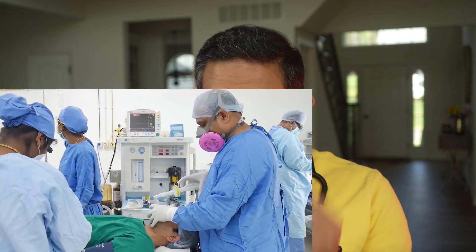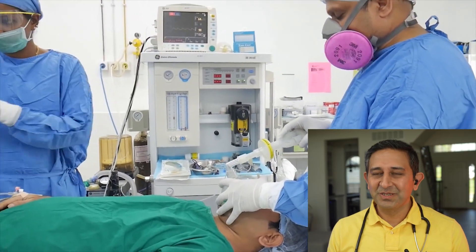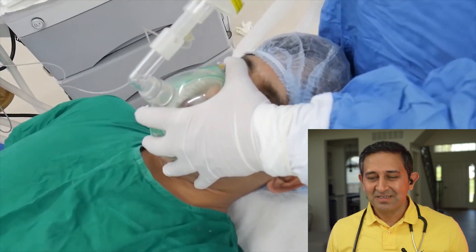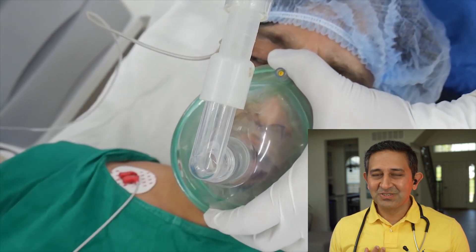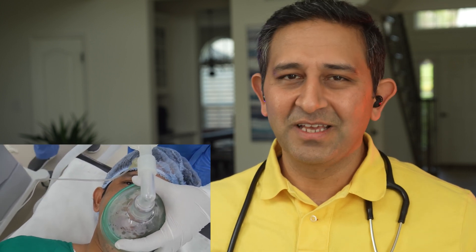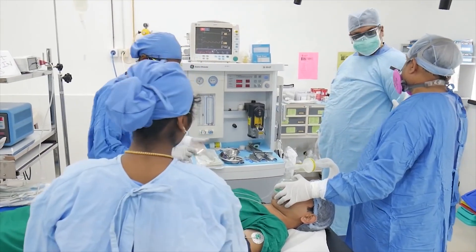This patient walked into the operation theater to get anesthesia. A mask is put on the patient's face to give oxygen and then they are trying to put the electrocardiogram leads to monitor the heart. Whenever there is a difficult anesthesia patient, it's customary to have two people trained in anesthesia to do these cases because these can be very challenging.